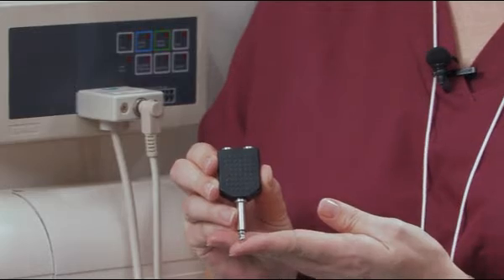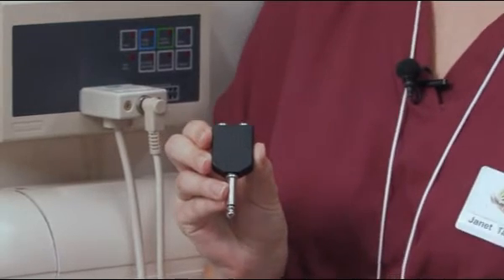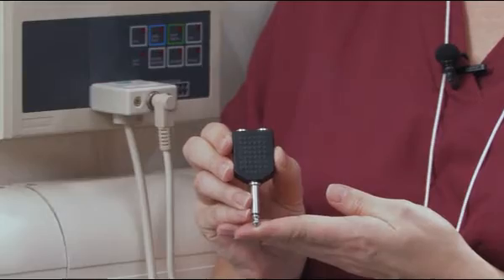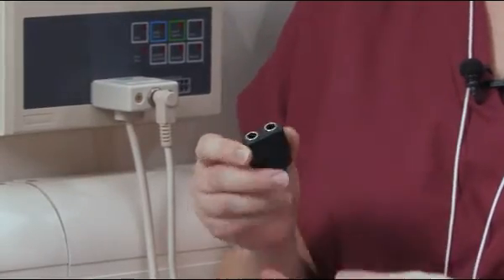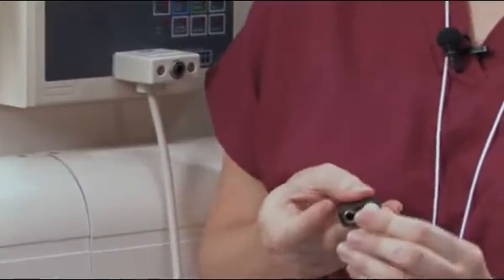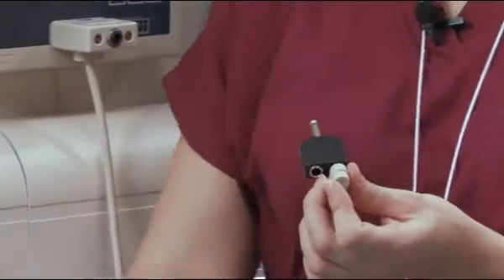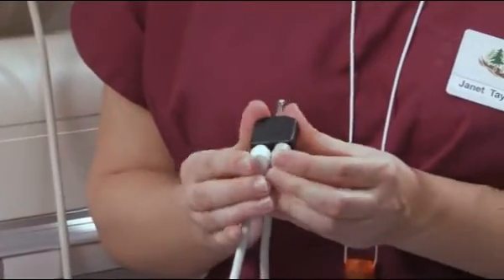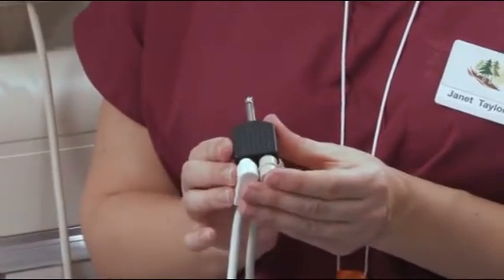In this case, use the T-Connector, model 0440137. Instead of simply plugging the monitor directly into the nurse call system, plug one end of the nurse call cord into one side of the optional T-Adapter, and the nurse call button into the other. Then plug this assembly into your nurse call system.